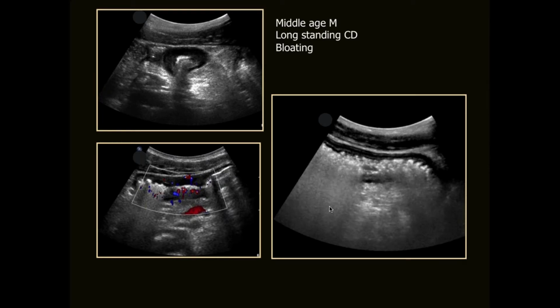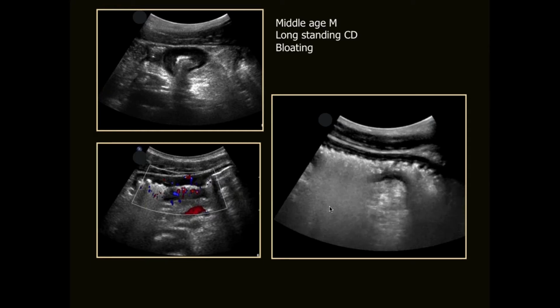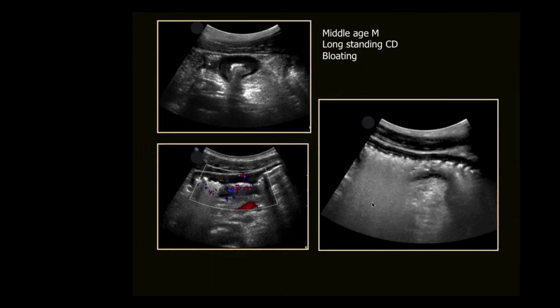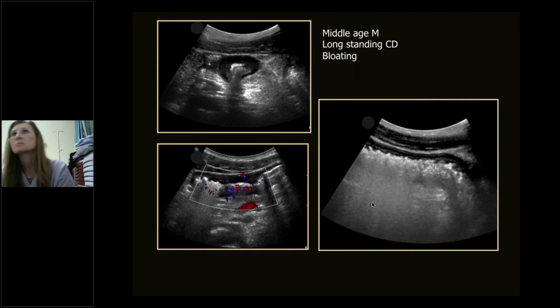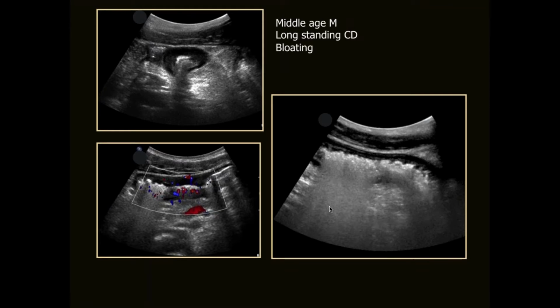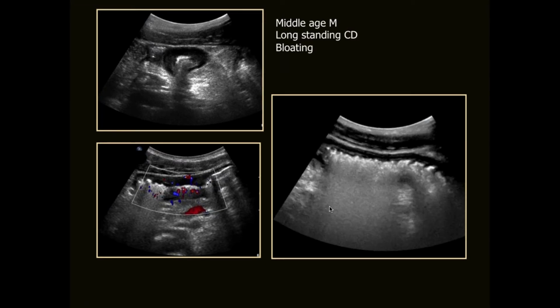And so patients who might, with a fasting abdomen, not show as much, as soon as we see this dysfunctional type of peristalsis, as we're looking at here, our questioning will often very quickly allow us to realize that bloating and obstructive symptoms are the things that are most troublesome to these patients. And so on the left panel, we can see a thickened segment of the bowel with loss of wall stratification. There's hyperemia and luminal apposition.